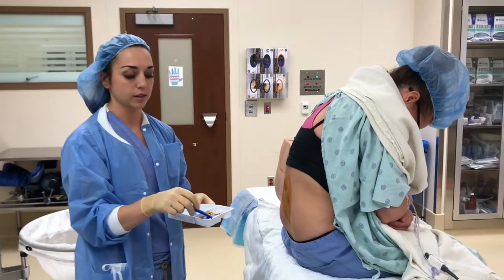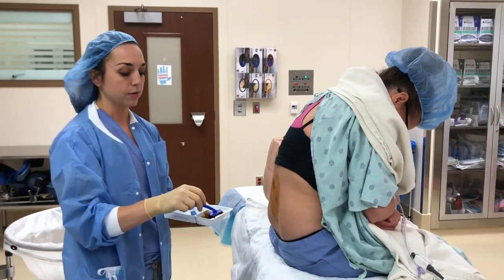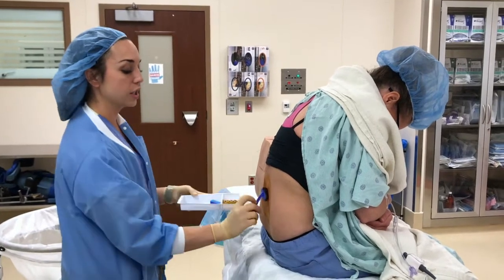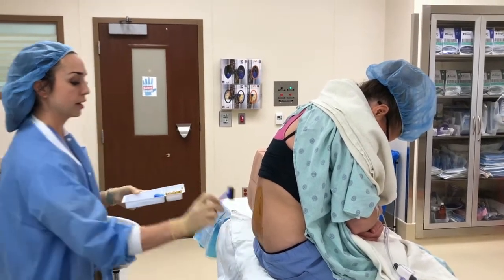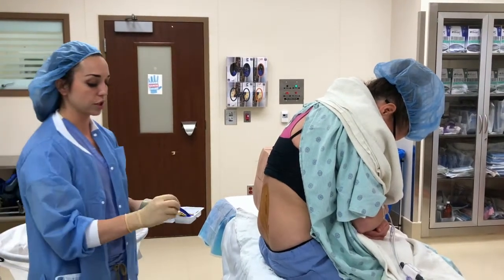Second one, take a nice amount of solution. All right, another cold, scratchy here on your back. Again, and one more cold, scratchy solution.